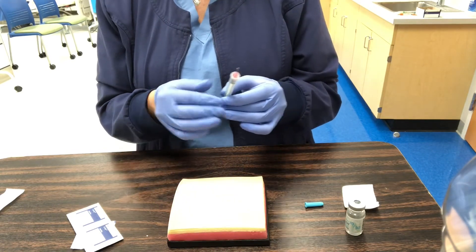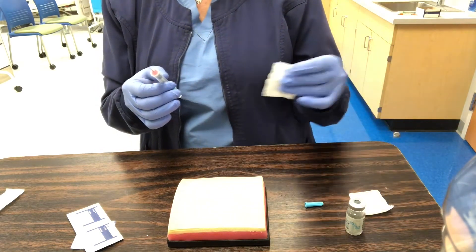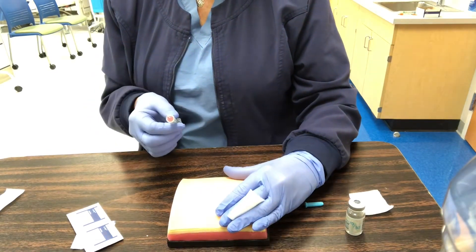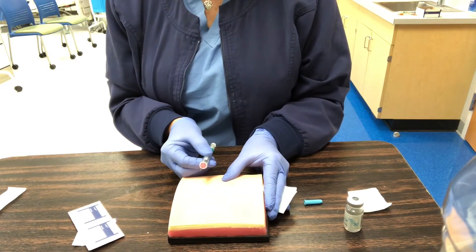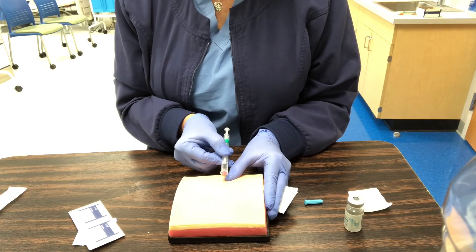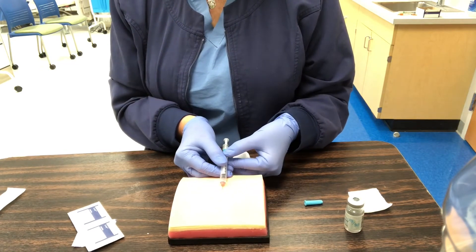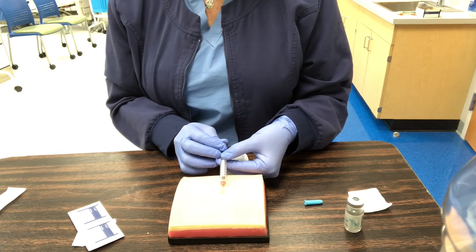Bevel up, and I want to get a two-by-two. I like to place the two-by-two between my ring and middle finger so it's ready for me. I'm going to pull the skin taut — not pinch up — using my thumb. Bevel up, 10 to 15 degrees, going in under the skin, and now I'm ready. I take my non-dominant hand to hold the syringe and slowly make my bleb — that's the little bubble that comes up under the skin.